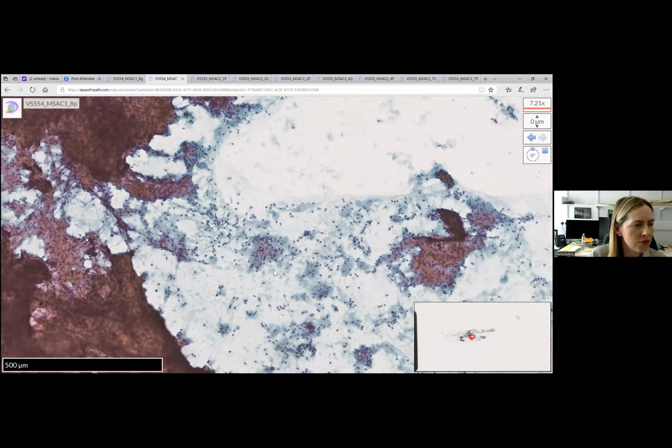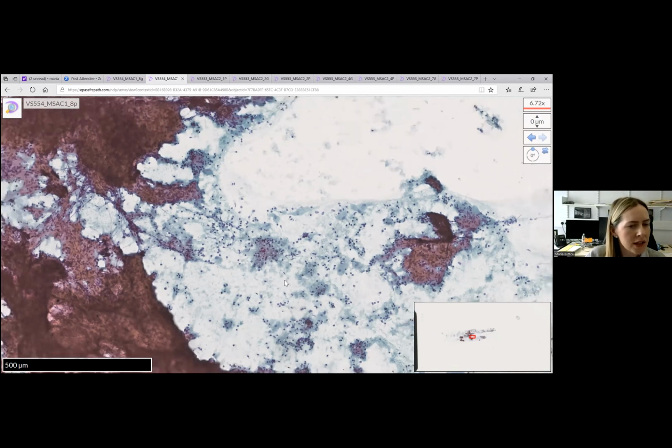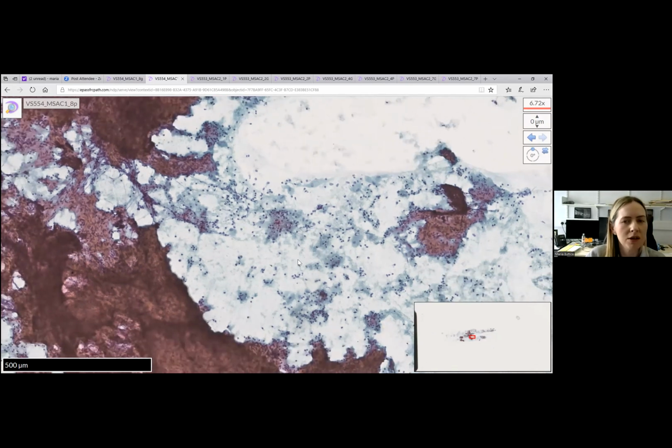My top 3 would be a Hodgkin's lymphoma, so when you see granulomas, have a look at the background, see if there are any RS or Hodgkin cells. The second one is a metastatic squamous cell carcinoma, because the keratin can often induce a granulomatous inflammation. And in the mediastinal lymph nodes in a young patient, consider germ cell tumours. But I thought this was a good quick example of non-necrotizing granulomatous inflammation. So any questions?